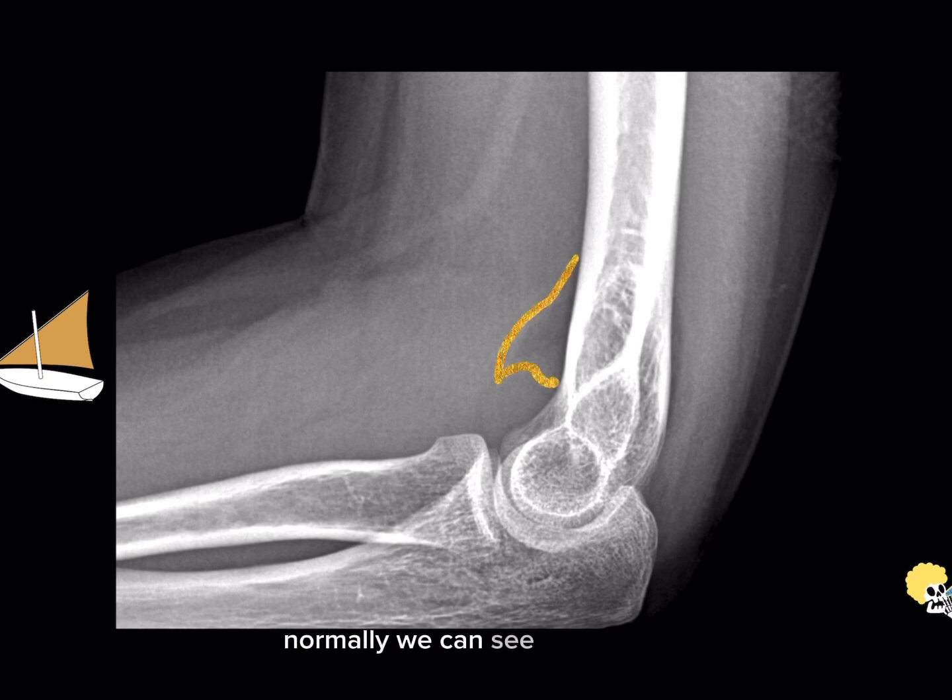Normally we can see this fat pad in a patient that has no significant effusion, so you have to keep in mind that it is only abnormal when it is displaced and looks like a sail, as in this case. On the other hand, the posterior fat pad — whenever we see it — is abnormal. The reason for that is that we have the triceps tendon running just posterior to the olecranon fossa, so to get displacement of this fat pad we really have to have a sizable effusion. When we see it, it's abnormal.